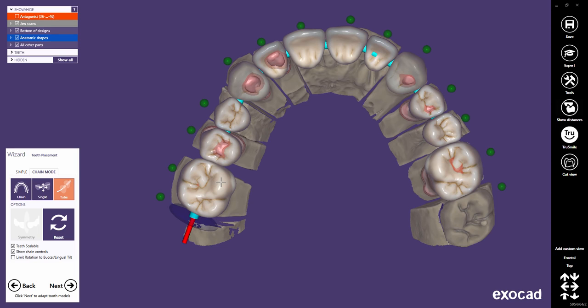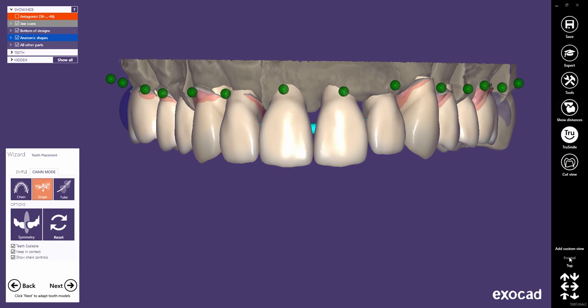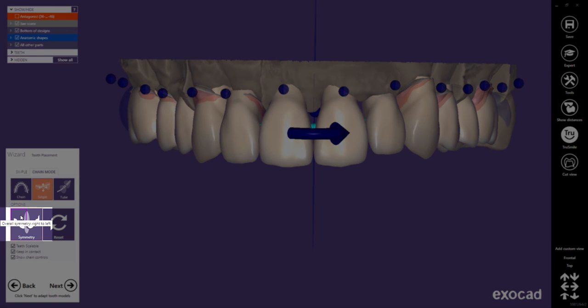We have now seen all modes in the Chain Mode tab. Let's have a look at another very interesting option — namely, the symmetry option. The symmetry button actually consists of four buttons.